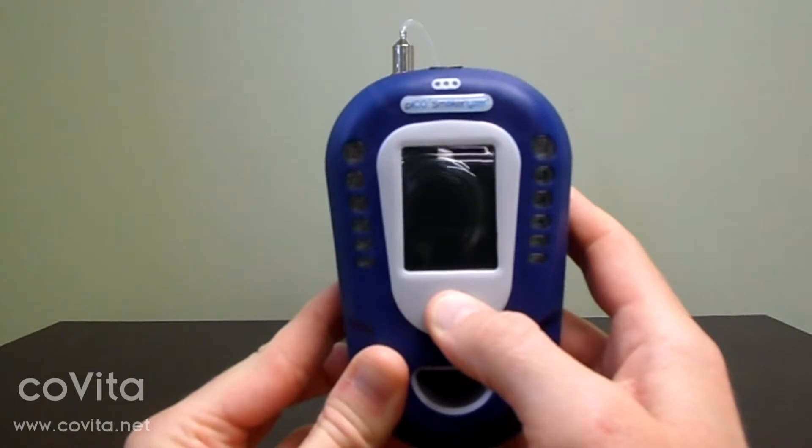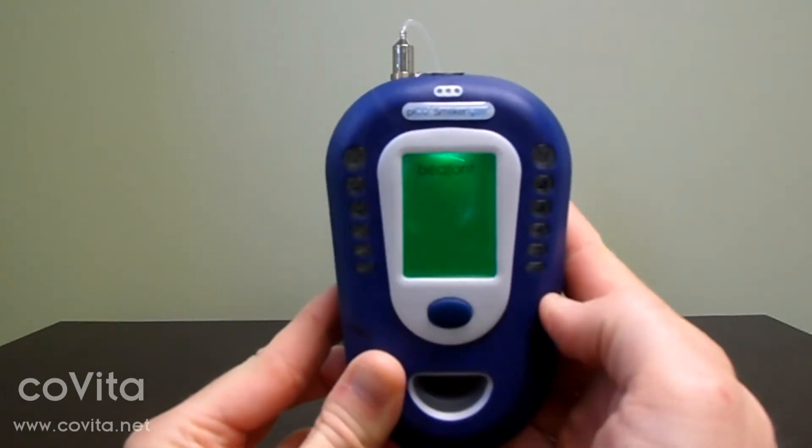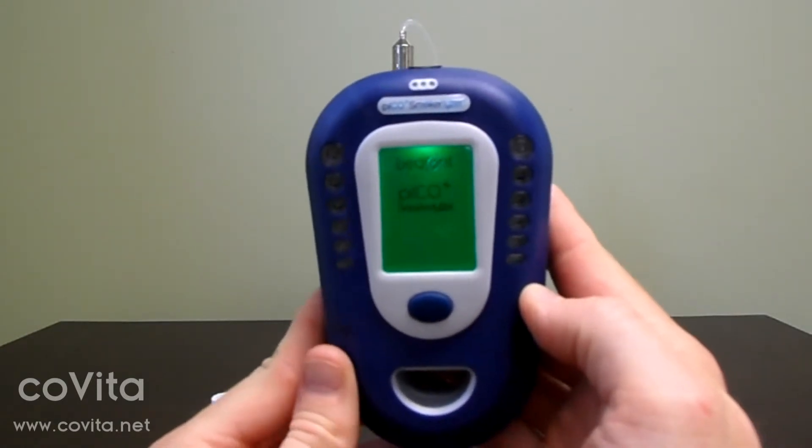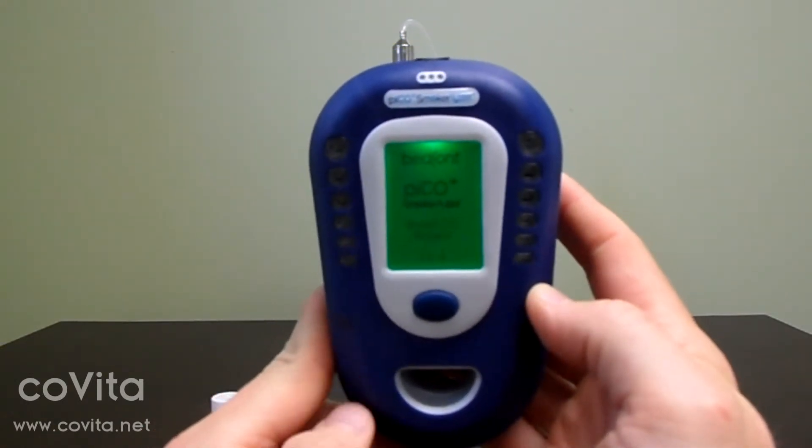Now, turn your monitor on by pressing and holding the power button for three seconds, then releasing. Allow your monitor to boot up to the home screen.